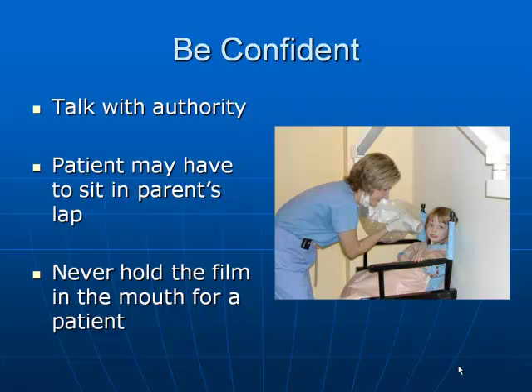It is important to be confident. Talk with authority. A patient may have to sit in a parent's lap, but if they do, always make sure you use a lead apron. It is important to never hold the film in the patient's mouth. You have to remember the ALARA protocol, as low as reasonably achievable.